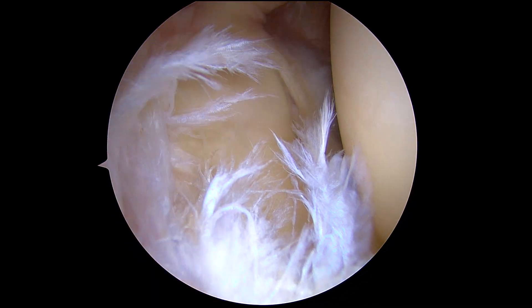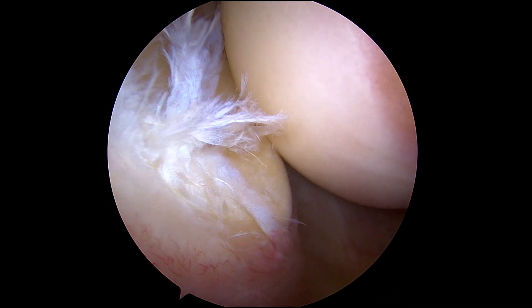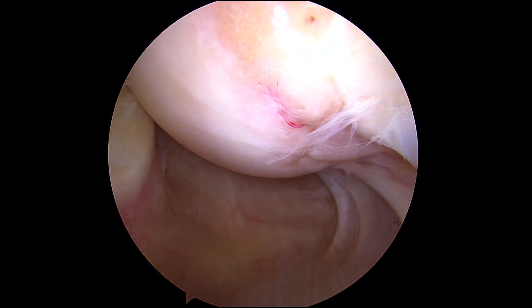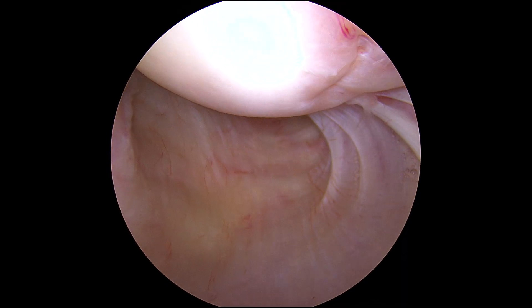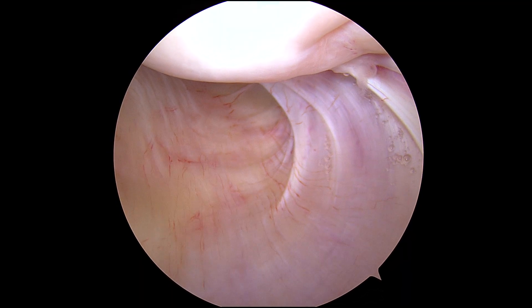Obviously that doesn't look like normal labral tissue as it does sort of there. She's got fraying and tearing that extends from the superior labrum all the way down the back into the posterior labrum. If you keep looking down into the inferior or axillary recess, that's the inferior glenohumeral ligament.